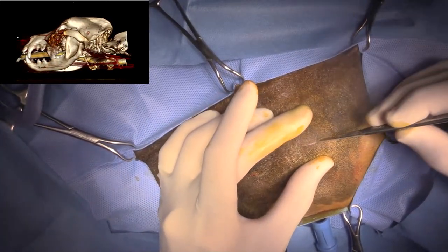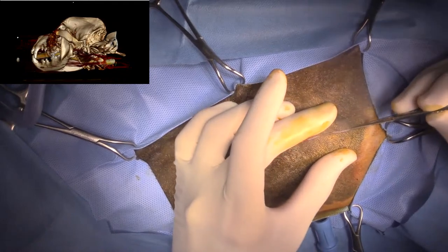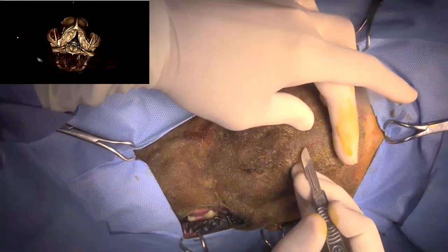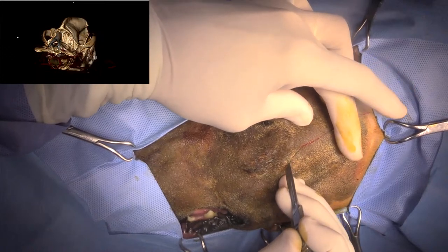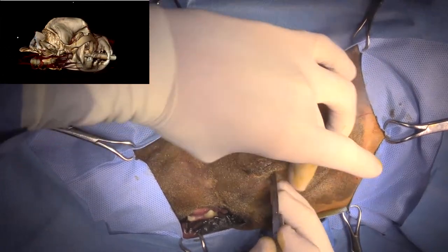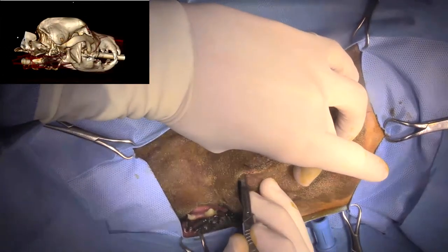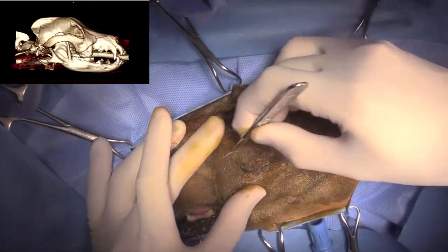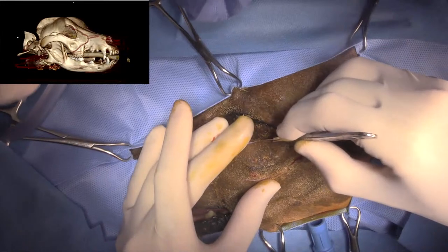So start my incision here. Extend that caudally. And then I'm going to make an ellipse out of the incision right over where the biopsy tract is, because that biopsy tract is contaminated. If you leave it in, you're very likely to get recurrence.